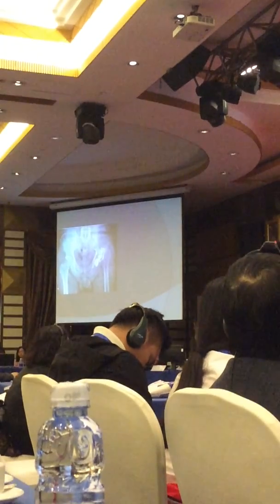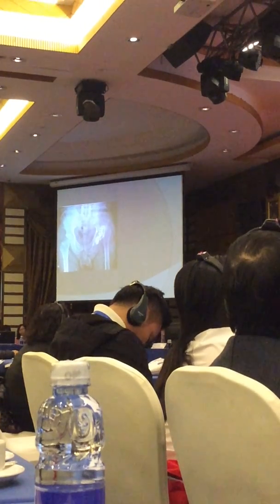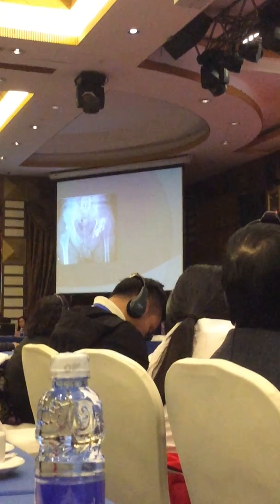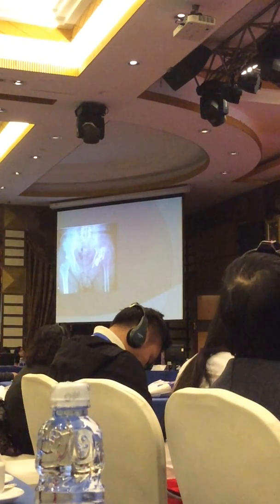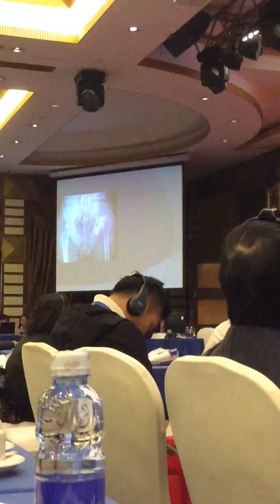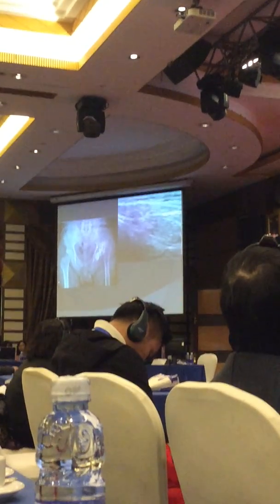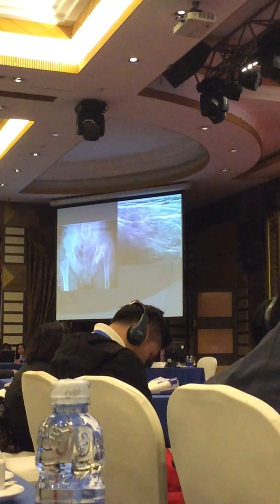This is a case of hip infection. At the left side, it was a post-op infection, so you see these antibiotic beads, and the clinician suspected infected fluid collection, which can't be seen on the radiography. When you do ultrasound, you can see that there's something going on at the post-op site at the hip joint.